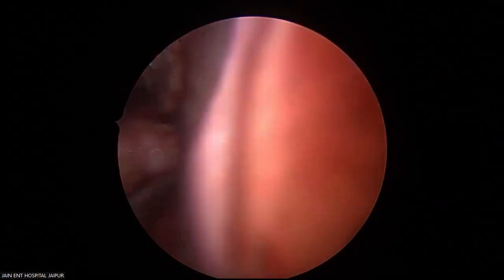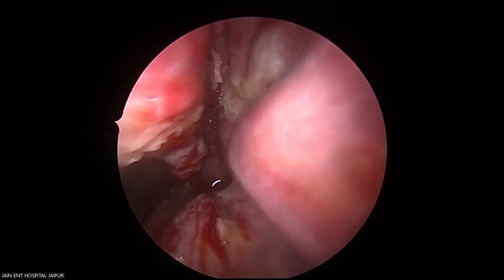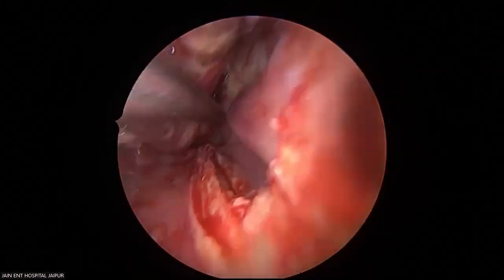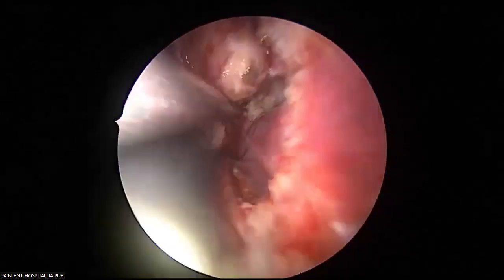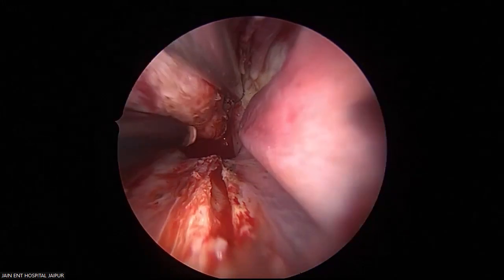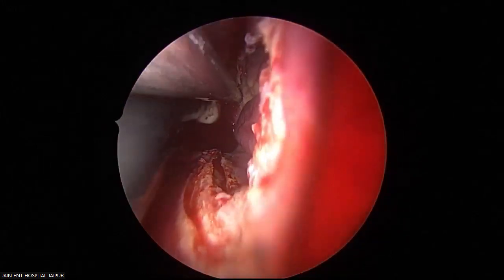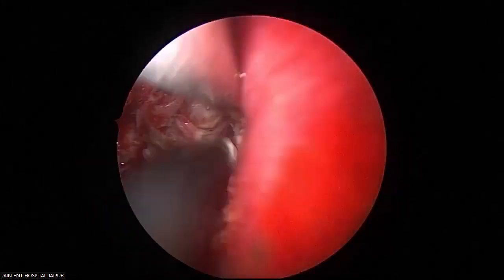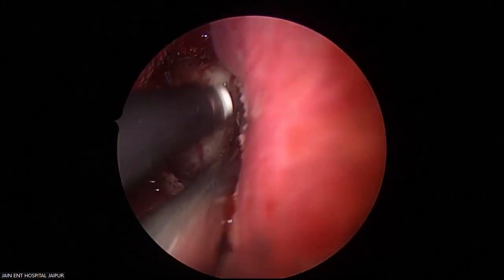See the entire tumor surface being coagulated wherever it is getting exposed.